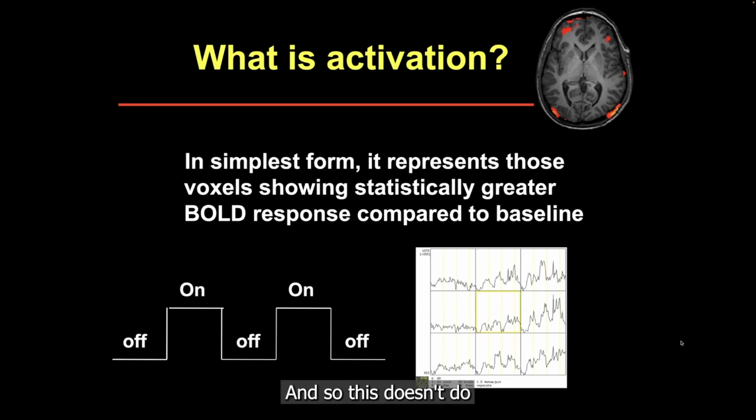And so this voxel doesn't look very active. This might be, this starts to look active. These look much better. It's not going to be perfect on, off. But what we're looking for is differences. For example, this voxel versus this voxel. Those are quite different, aren't they?